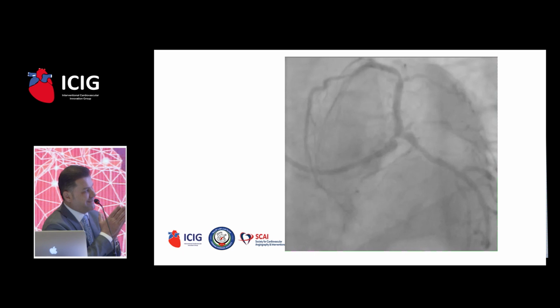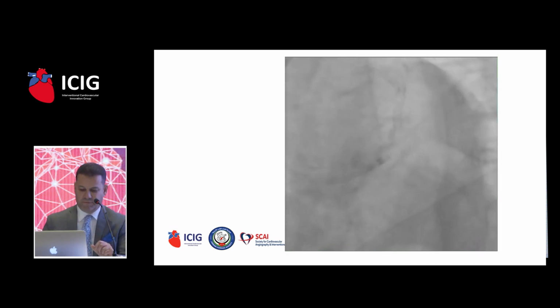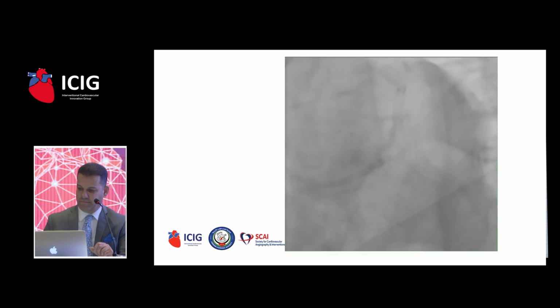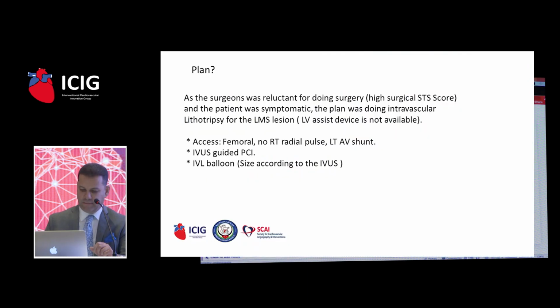For this case, the patient was sent to the surgeon, but the surgeon declined the surgery for this lady as she's 82 years old, and the family and the patient also declined the surgery. So at that time we decided to do PCI for this lady.